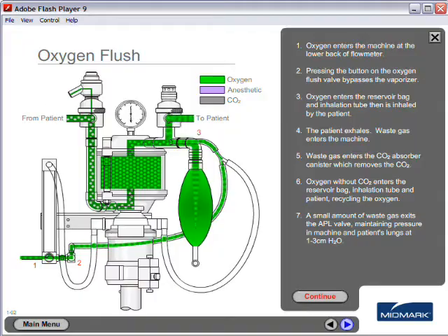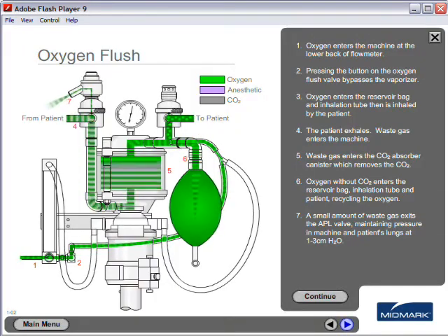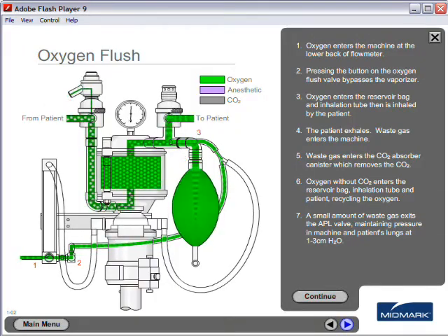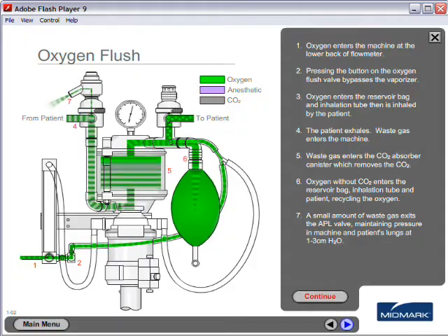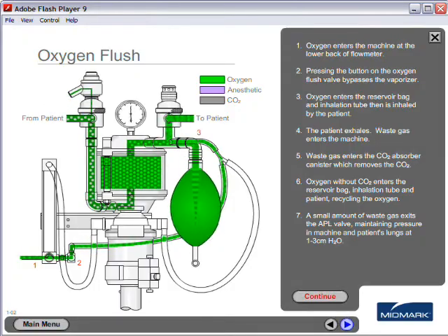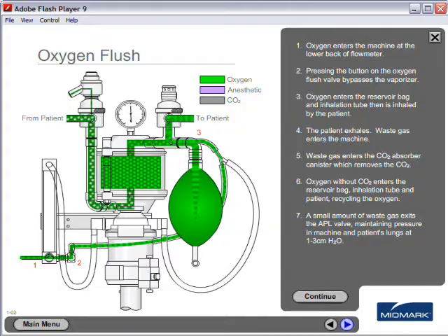Oxygen enters the reservoir bag and inhalation tube, then is inhaled by the patient. The patient exhales and waste gas enters the machine.